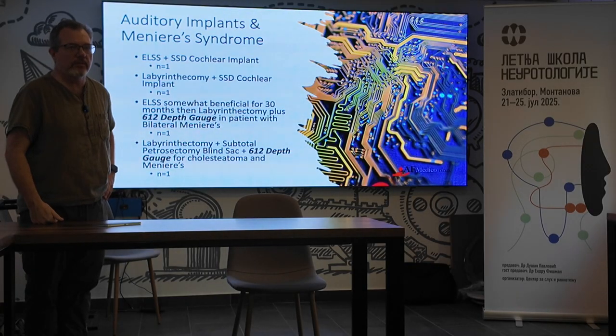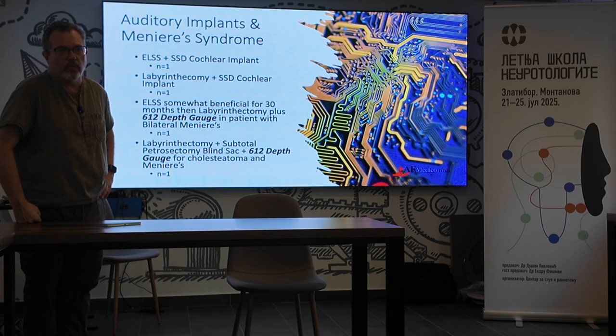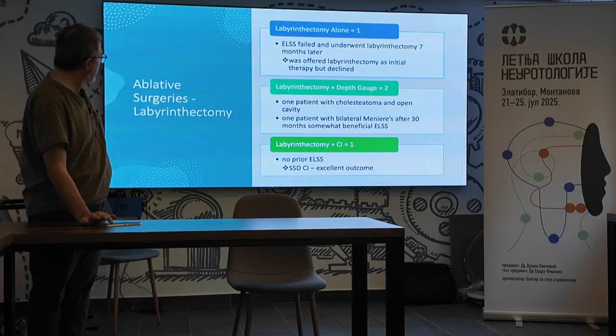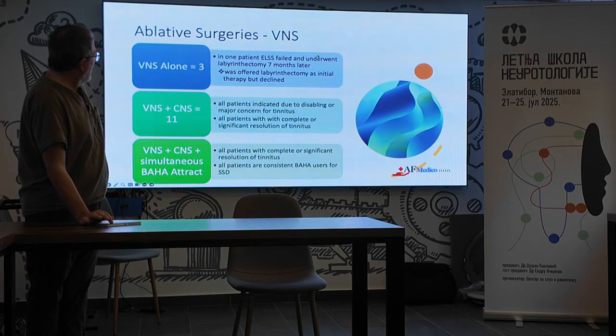So it's also possible to put in a temporary electrode in plans for future cochlear implantation. The reason you have to do this is once you do anything else to the inner ear, they will fibrose the inner ear and you won't be able to put an electrode. So some procedures require you put a temporary electrode. Now, let's just go now to the overall series.